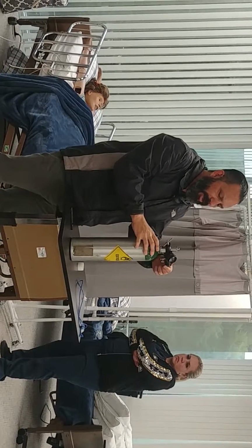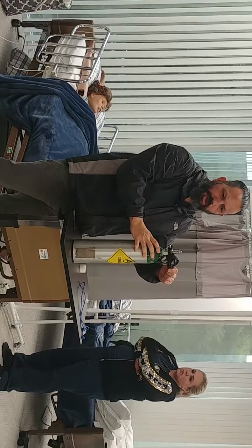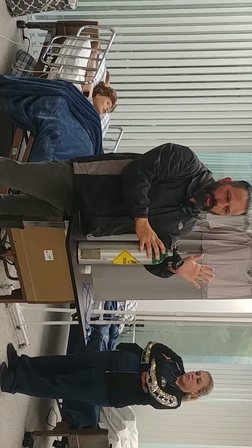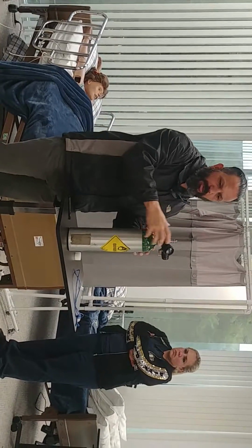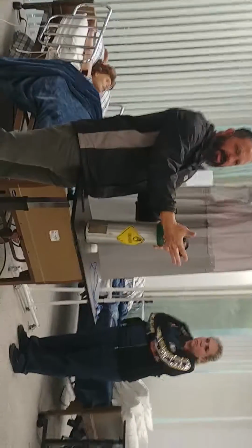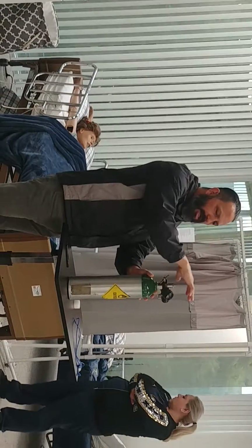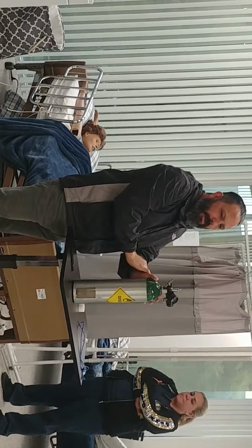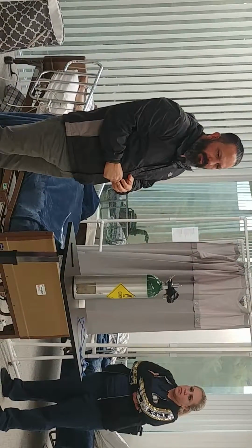So the next thing that we're going to do, once we close the main system, is go ahead and purge the system. Now we just drained whatever residual was left in the regulator. And you're going to see the gauges, the needles, go all the way to 0, because now it's not getting anything else from here to here. So now we can take the regulator off.